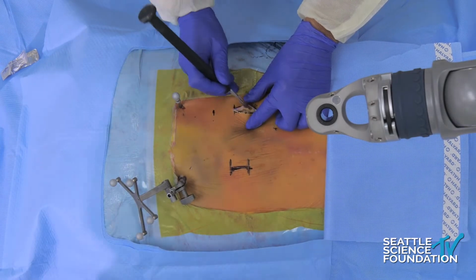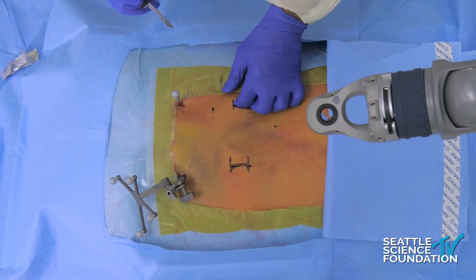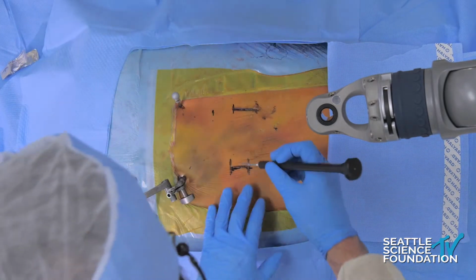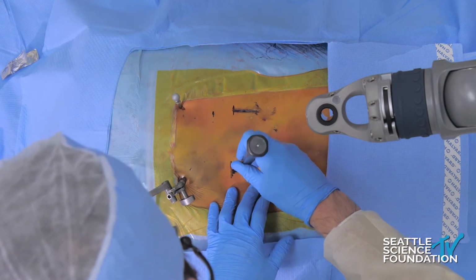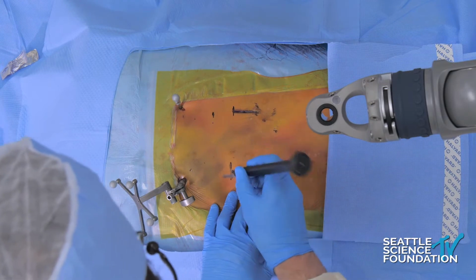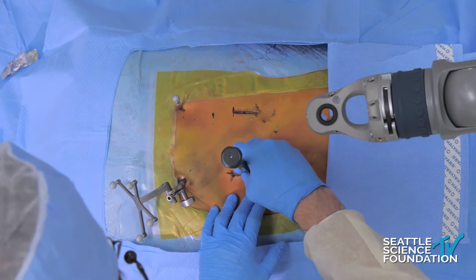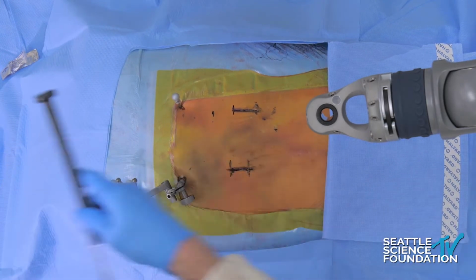I typically like to go through the fascia. Don't have a bovie around, but the knife typically will let me do that. Here you are. Thank you. So I'm going to start with my screw, left L3, and then make it a little bit longer, Nathan, the incision, just for the purpose of the screw. Yeah. That's it. That's great. And you may go through that superficial and deep layer of the lumbodorsal fascia. Yeah, I think great. Okay.